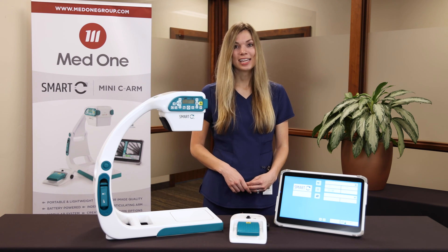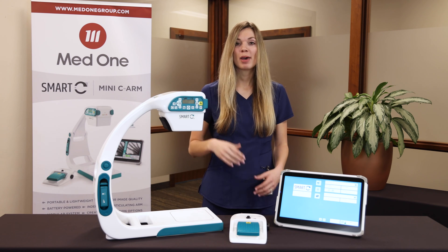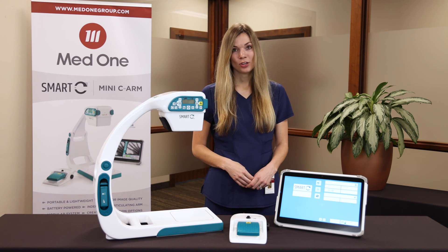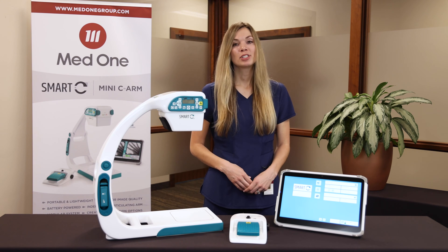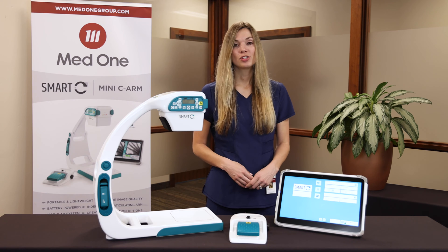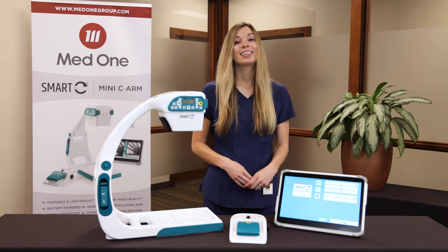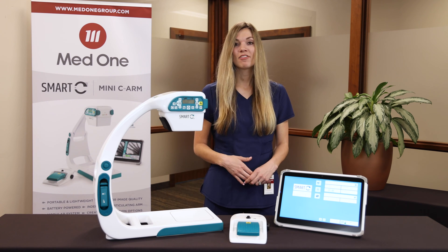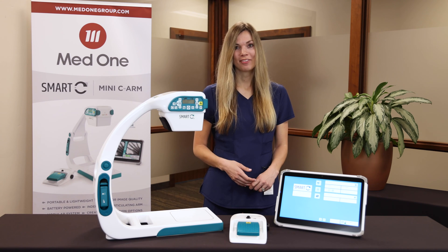The Smart-C offers many advantages. It's small and compact, so you get better workspace access and true portability. It is easy to use, surgeon-operated, and it does not require a radiographer, so you can reduce delays and lower the cost of surgery. It can also reduce screening time and therefore the radiation dose to the provider and patient. And lastly, it is not limited to just one clinical environment — it has the flexibility to perform in surgery, in clinics, or on the sidelines of a sporting event.